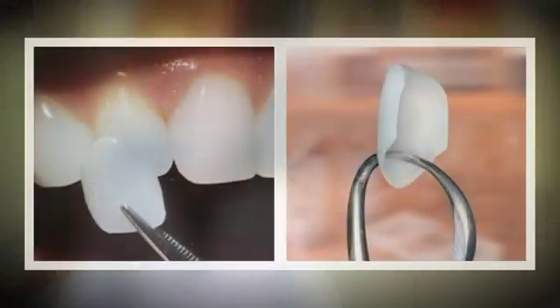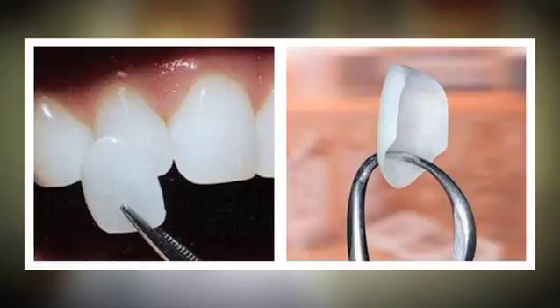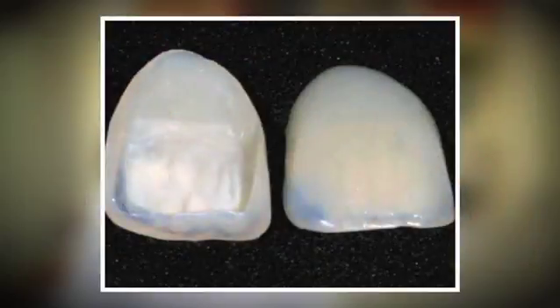That would be a clinical visit where we then begin preparing or not preparing the teeth for the new smile design. The preparation visit can be very minimal if we're doing no preparation type veneers, or it can be more extensive. And in a more extensive case, we would be preparing the teeth, possibly changing the shape of the gum tissue around the teeth, and the patient would go home with provisional restorations that mimic the smile design.